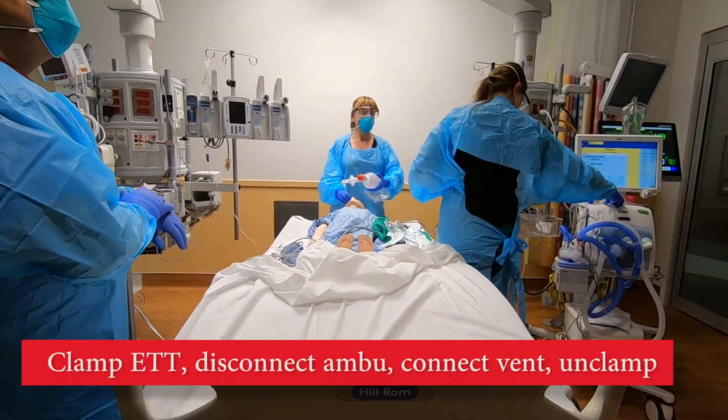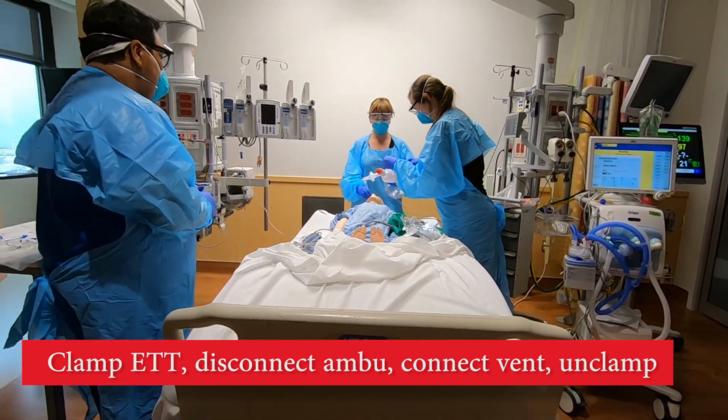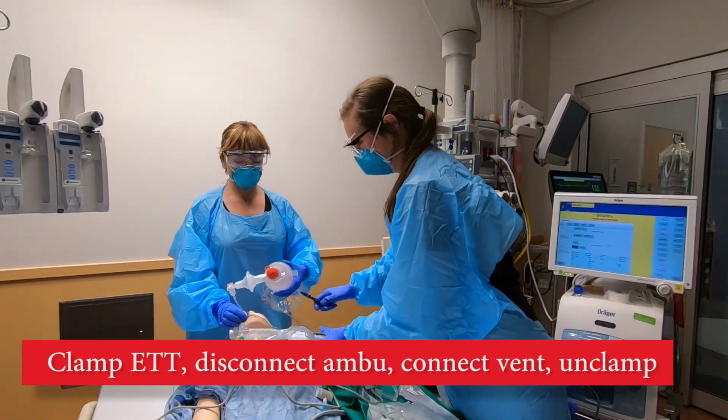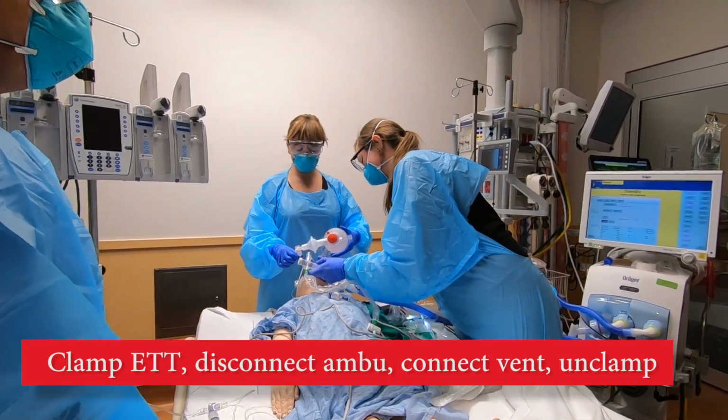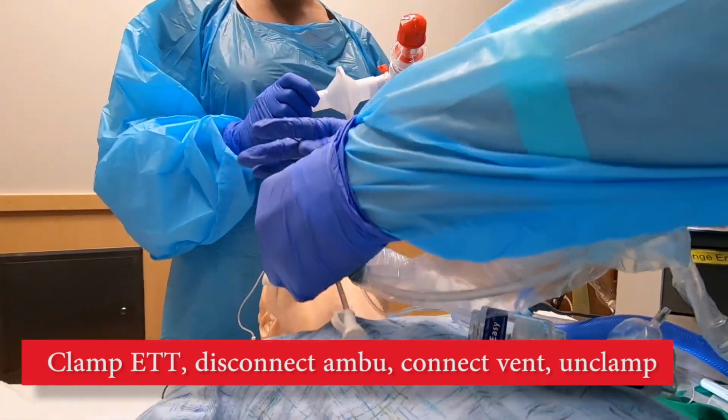Rapid sequence intubation with minimal or no bag mask ventilation is preferred. After tube placement, inflating the cuff before bagging will also minimize aerosolization. Disconnect.